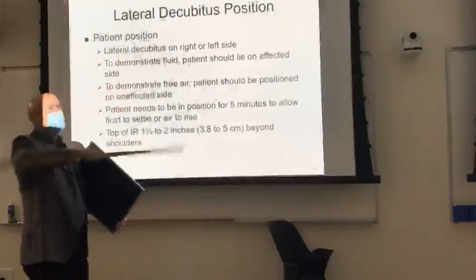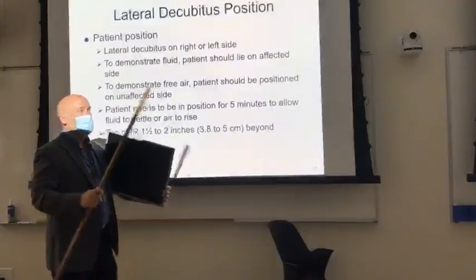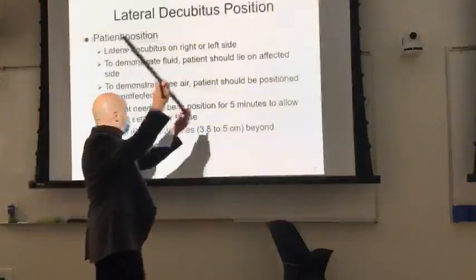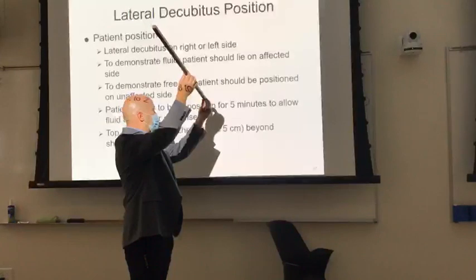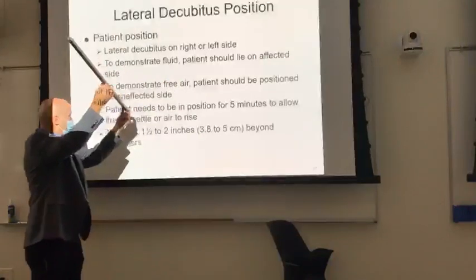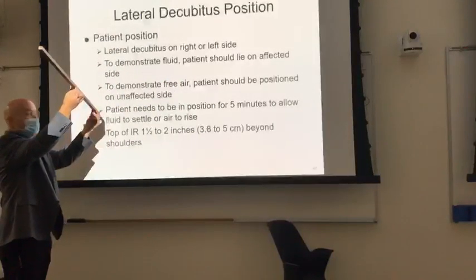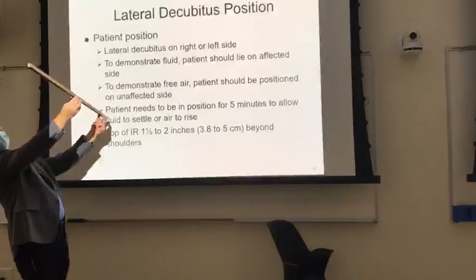I mean, all that light comes from a little bitty spot up in there, right? So it's got to spread out. So watch what happens, if I can make this happen. Watch what happens to the appearance of this thing if I have it pretty much going parallel to the light source. You see how small it gets? Now if I can walk over this way, look what happens to the shadow of it. You see the way it distorts? Okay? I tried not to move this much, but can you see?